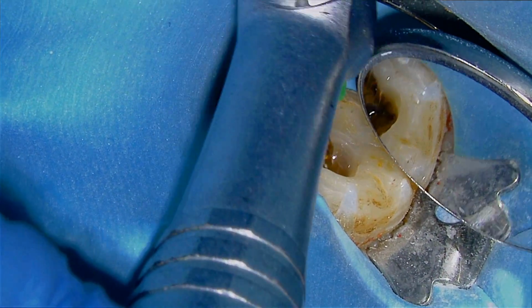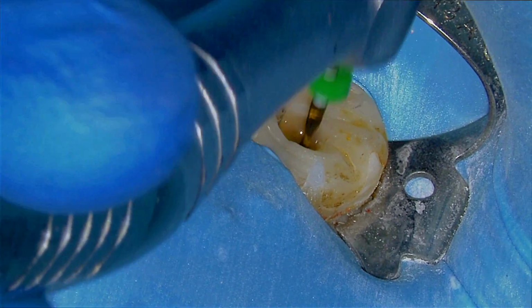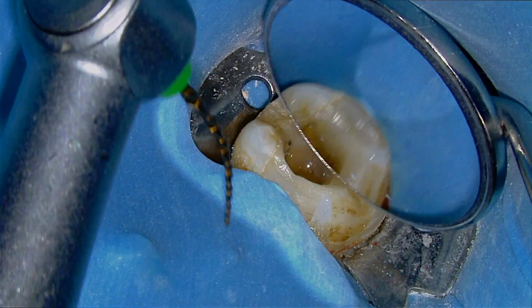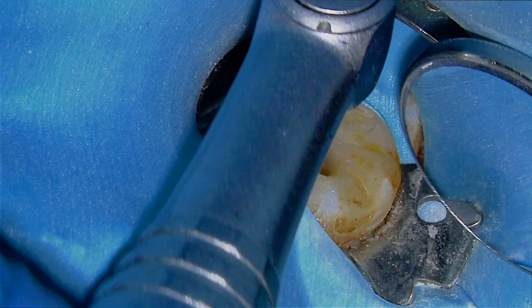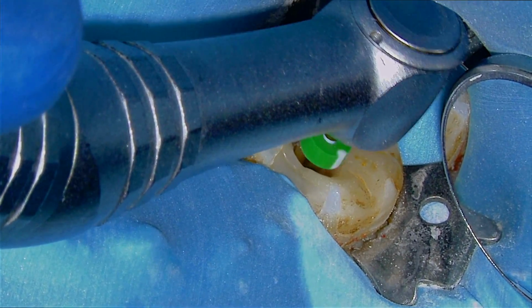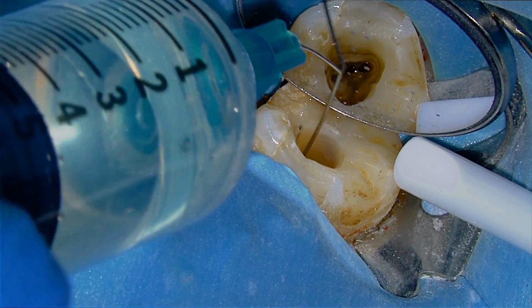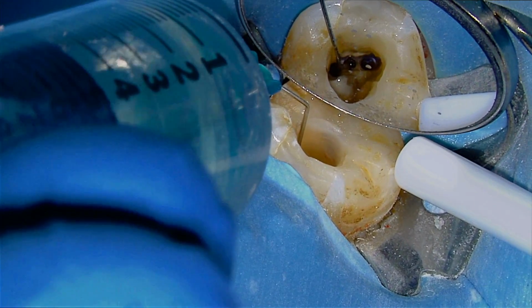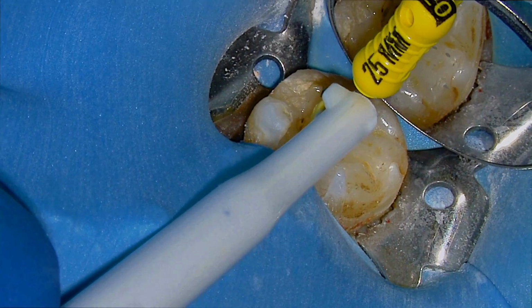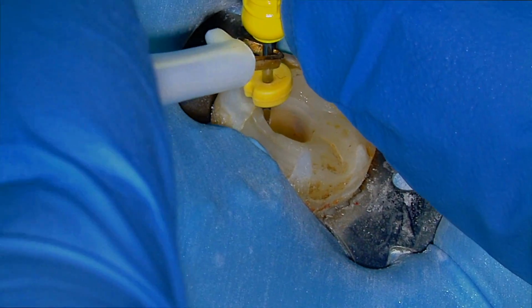Okay, so we're going to clean and shape everything to a medium, and you ask, well, what about the danger zone? This file is not going all the way to length in that middle mesial because it joins up with the mesiolingual, so I'm not too concerned. So we're going to clean and shape to a 35.06, and then we're going to irrigate like Niagara Falls. This is a super high speed video of irrigation, but we actually use a 12 milliliter irrigating syringe, and we'll empty that at least once. I'm going to reconfirm my working lengths.